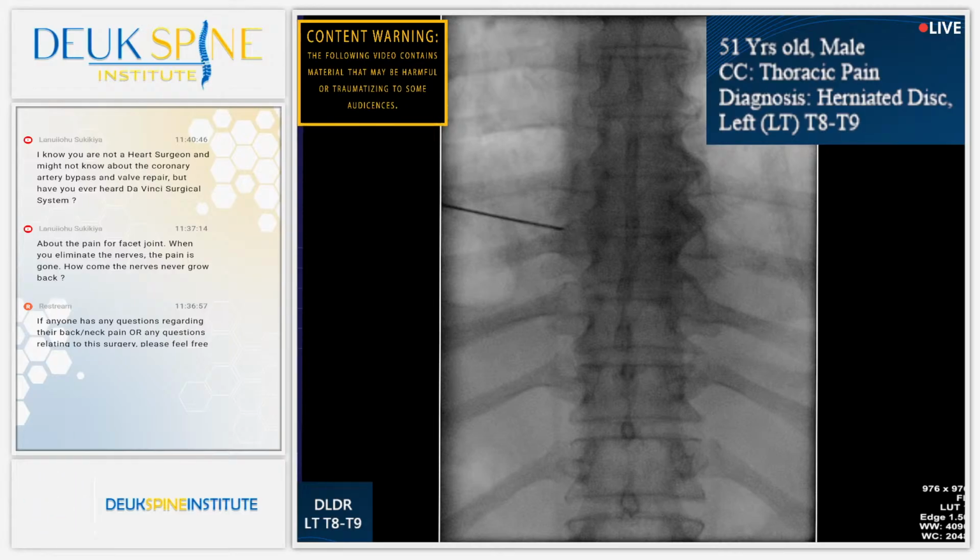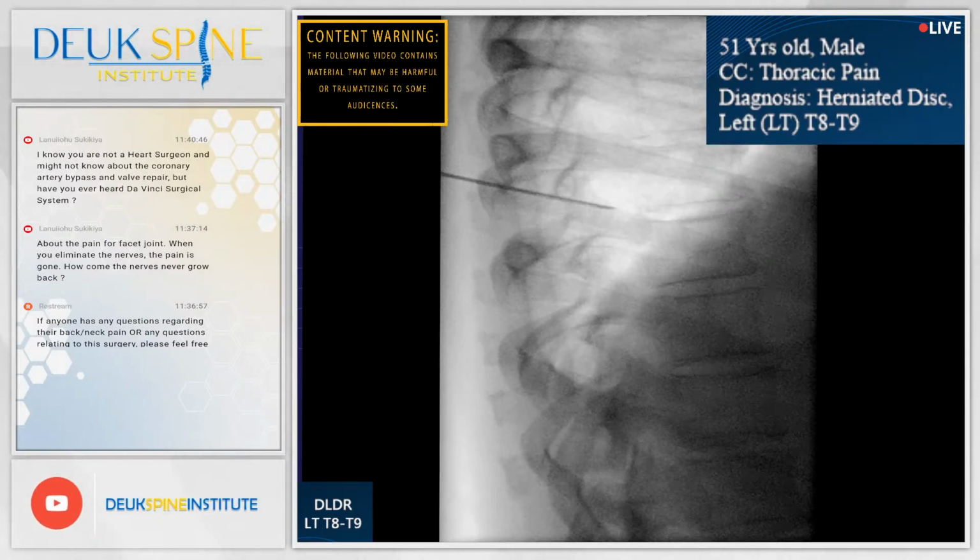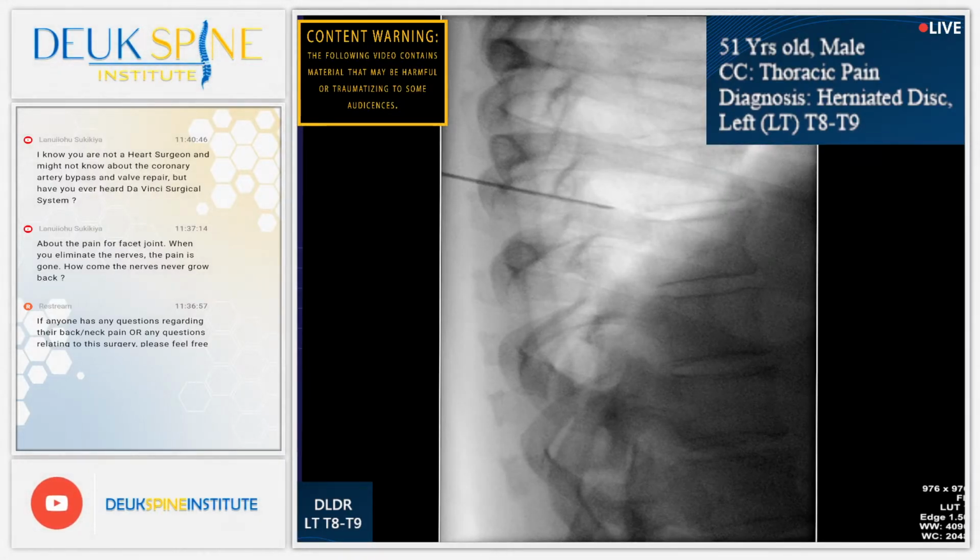I just feel like we're a little bit lateral. I want to be more medial, but there's something not letting me go more medial. It feels like bone spur.